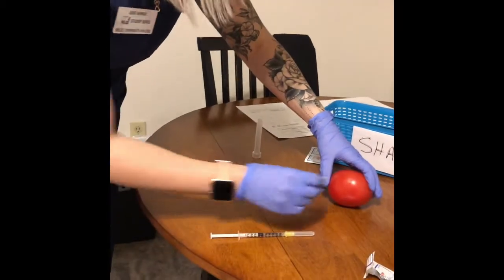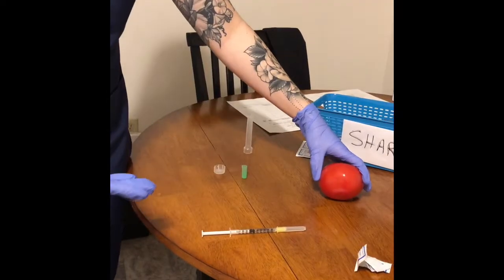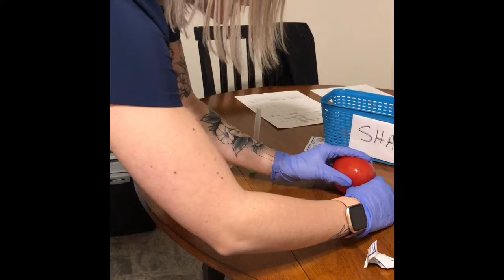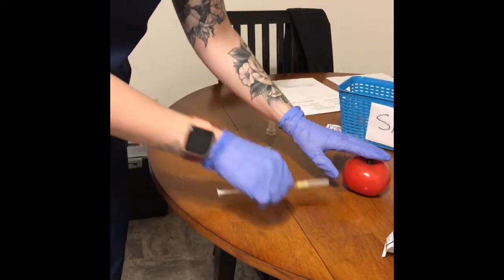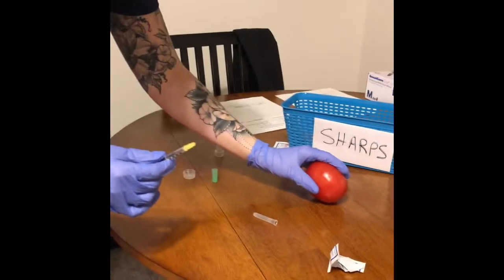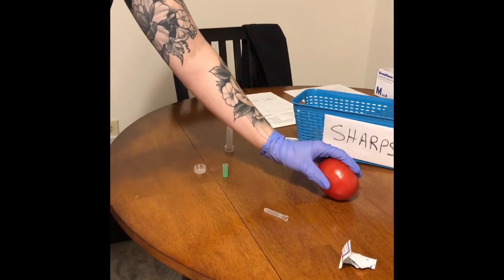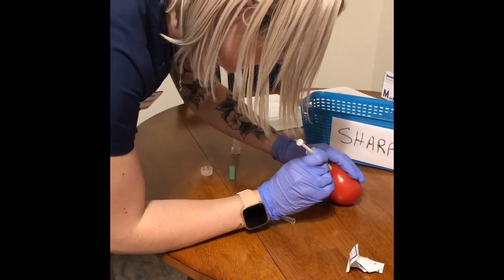You start in the middle and come outward and allow time to dry. You are going to want to pinch the site a little bit when you're ready, but you're going to get your cap out or off your injection. So you're going to pinch the skin with your non-dominant hand, and with your dominant hand you want the bevel up. You're going to go at a 90-degree angle.